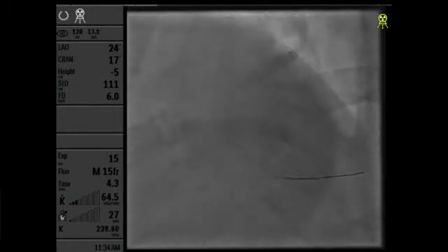So for those who are not familiar with the system, maybe after you place the balloon, you'll show all the components because it was just approved in the US a month ago.